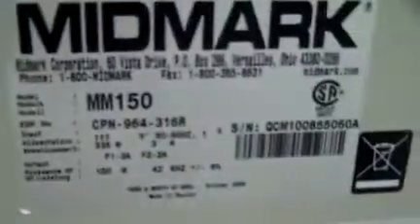The tray is in good condition. As you can see, it's just in really nice cosmetic condition.